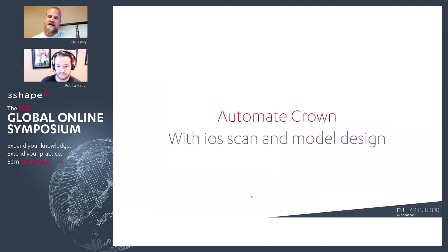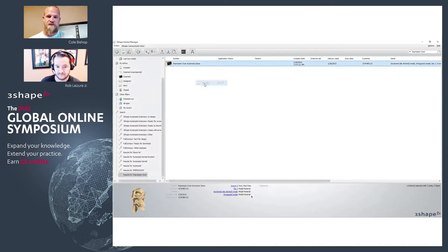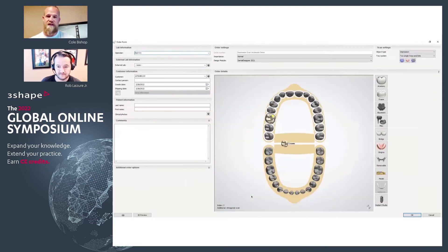So, IOS scans and model design. Simply today it's very easy to bring in an impression scan and send that over but still work on the model in-house. You just simply create your order as an impression with triple tray.